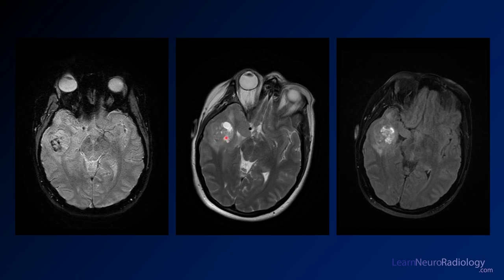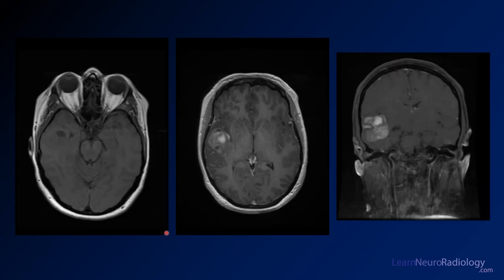On the T2, you see areas that look more solid and areas that look more T2 hyperintense. On the FLAIR, you get that same appearance in the temporal lobe. On post-contrast imaging, it's pretty isointense to brain except for the cystic part. On the post-contrast images you get a very irregular, strange-looking appearance with a lot of avid enhancement — but that's what these tumors can look like.